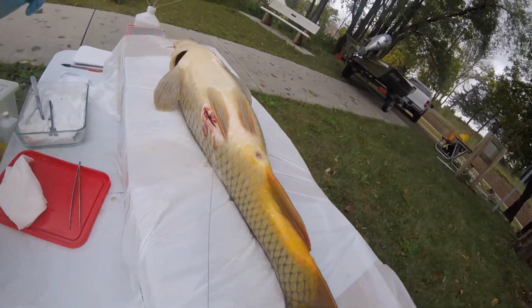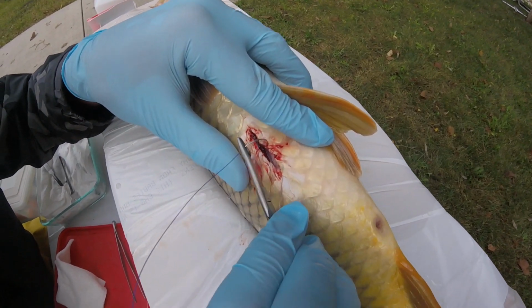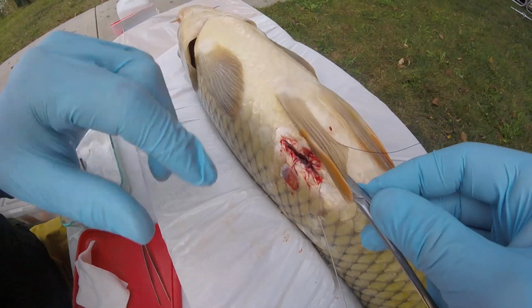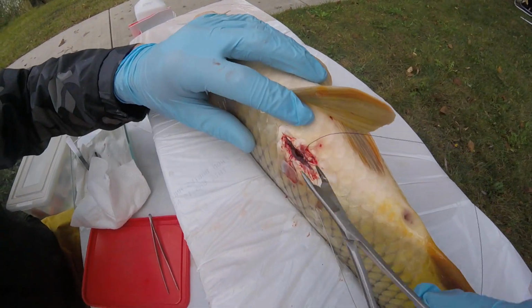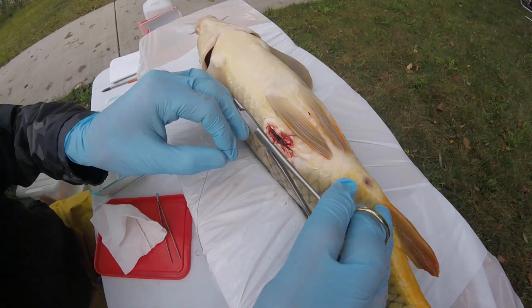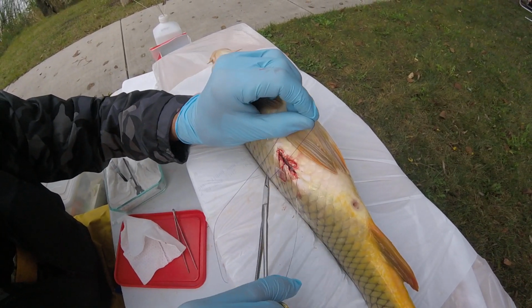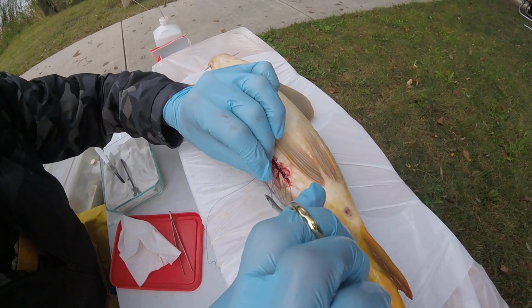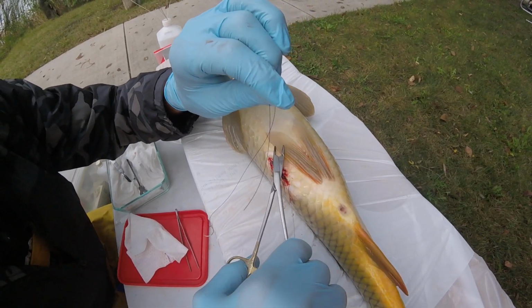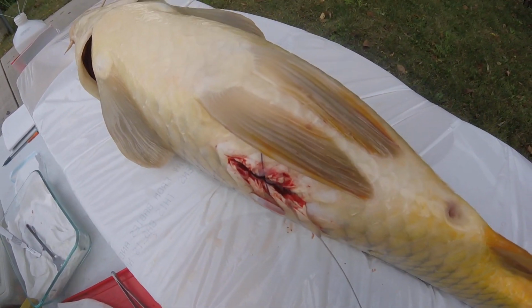And then it's time for sutures? Yep, now it's just the same. So what you saw before, just going to go as shallow as possible under the skin, not through the muscle wall. And these are dissolvable stitches, so they'll hold that thing shut for a few days. Just a half hitch on the... Yep, so we do one good old surgeon knot, 2, 3 to lock it. Okay. And then trim, and... Sorry. No, that's fine. You're fine.